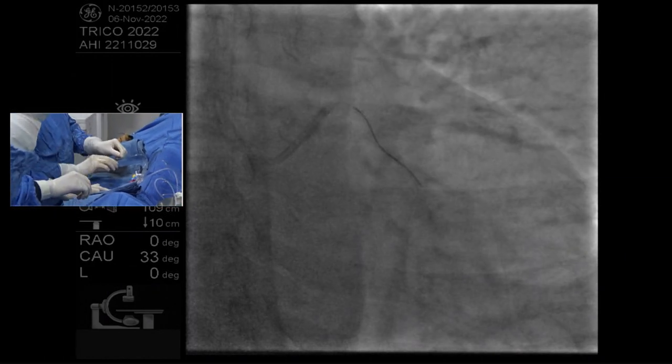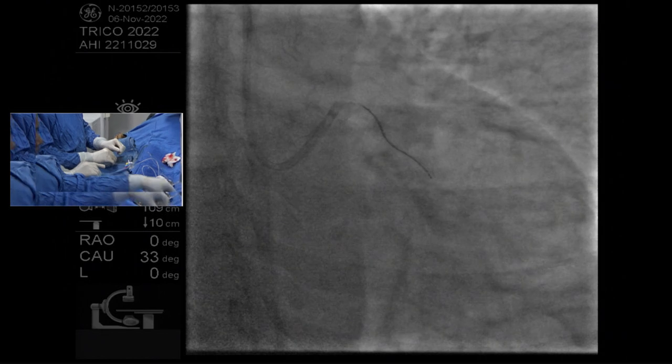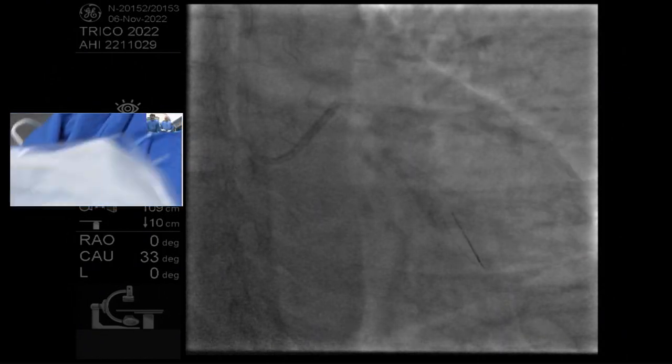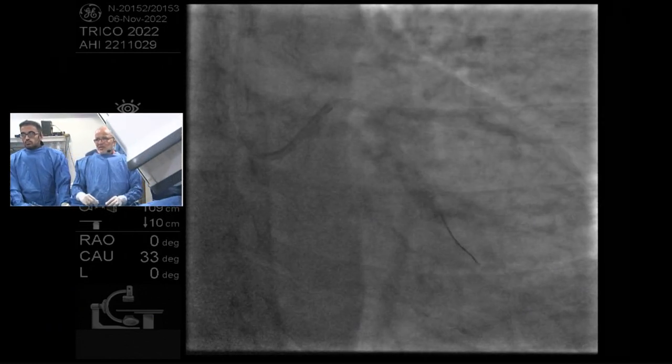Lovely. So, your wire's coming. No problem. So this is no big deal when you haven't dilated. When you've dilated, it's never a good thing. Yeah, that's right. So we'll put this wire down into OM1 and now. I think we need to learn this.